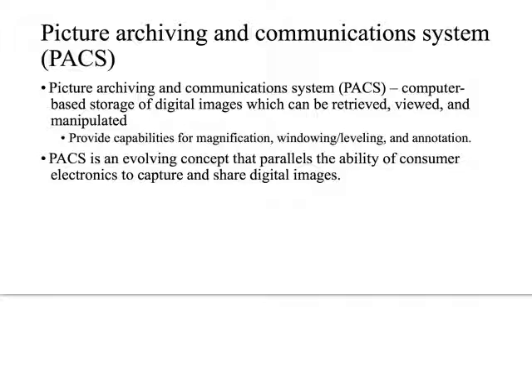I'm actually working on building a small PACS here at the school of our film library, and I'm working with the juniors to build that right now. It's going to have additional capabilities like magnification, windowing, leveling, and adding image annotation. And it's an evolving concept, so it's going to continue to parallel the availability of consumer electronics to capture and share digital images, much more so than, for example, our X-ray machine or my CT machine. For example, there's no reason why at this point in time in history I couldn't run the CT machine with my cell phone using a Bluetooth connection, right?